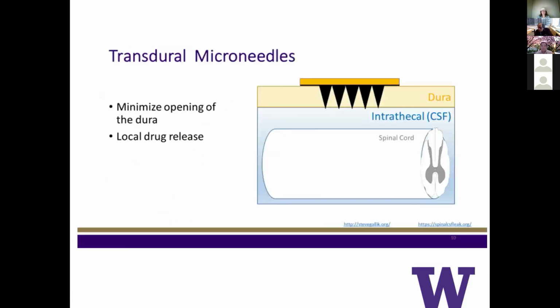One concept we've been working on for a number of years is this idea of transdural microneedles. I had this concept while operating and thinking about different devices. I'm certainly not the only person interested in some concept of local drug delivery to the spinal cord, but there really hasn't been another demonstration of something that you could implant epidurally that could then deliver drugs intrathecally. And so what I wanted to do was have a platform where we could deliver something just like that.